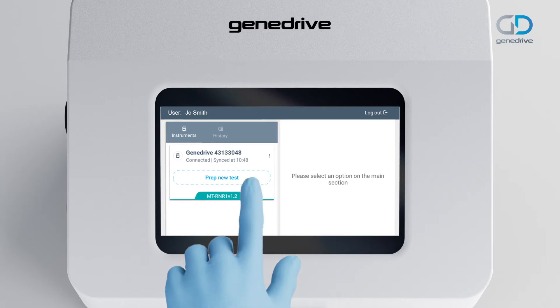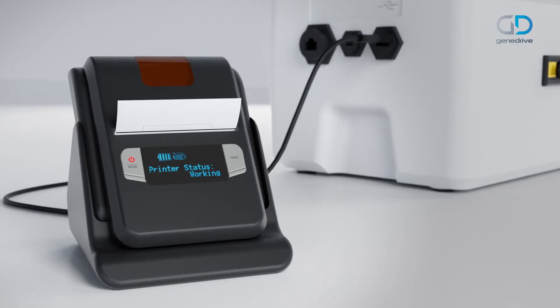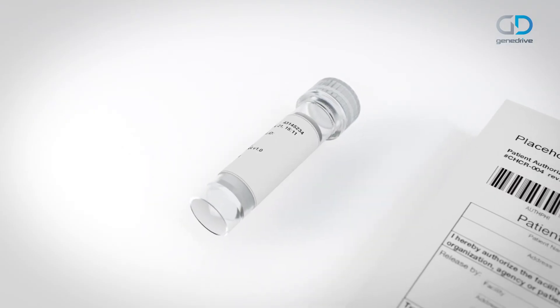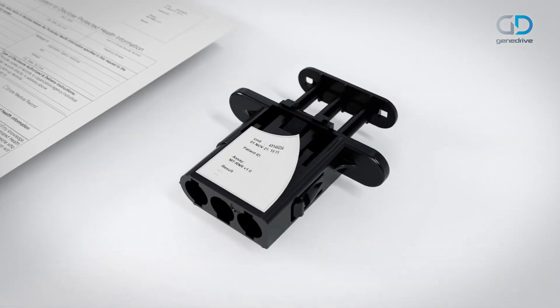Click on Prep New Test. Input the data as required, completing all compulsory fields. If an optional printer is connected, print labels. Attach one label to the buffer tube, one to the patient record, and one to the GeneDrive cartridge lid.